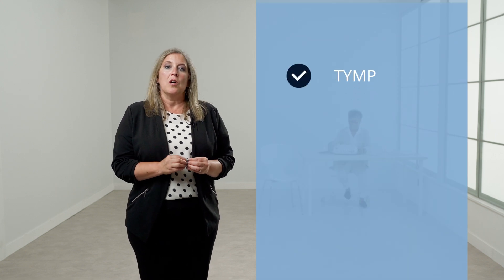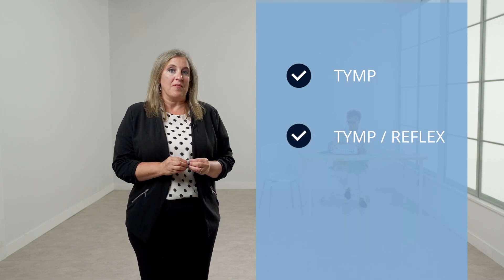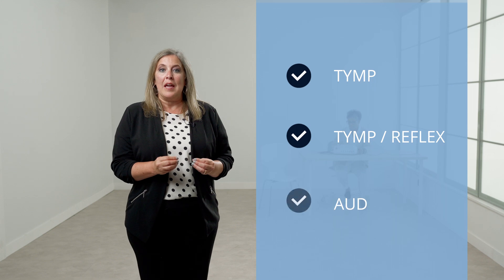The GSI 39 will look the same no matter which version is purchased. Every version will have the same button layout, but depending on which test types are active with the version you purchase, some of the buttons may not be functional. It is possible to upgrade to a different version at any time. To select a test, choose from the three test type buttons. TIMP will load the protocol for tympanometry testing only. TIMP/Reflex will load the protocol for tympanometry and reflex testing, and AUD will load the protocol for audiometric testing.